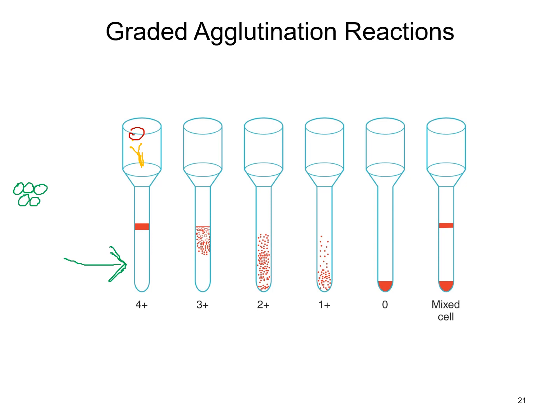And so we're basically allowing time for those red cells to start to come together, forming those bridges from those antibodies that bridge them together. Now, the red blood cells themselves, when they originally start off, are a little bit smaller than these gel particles. So if you have a negative reaction, it will flow through that gel well and then sink all the way to the bottom. So that gives us our negative reaction.